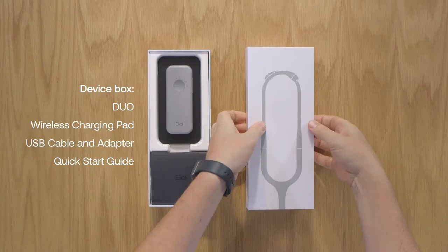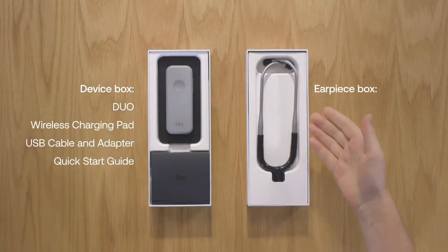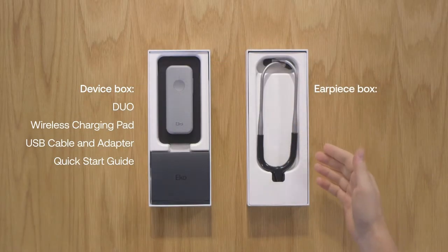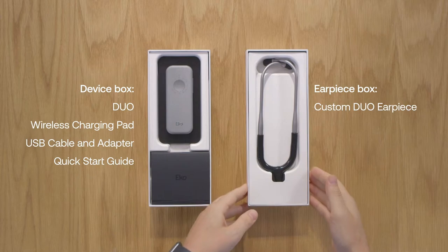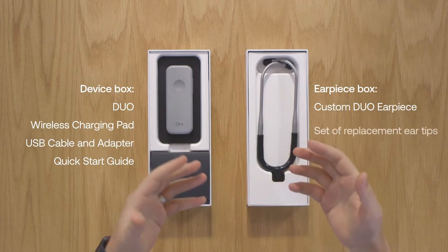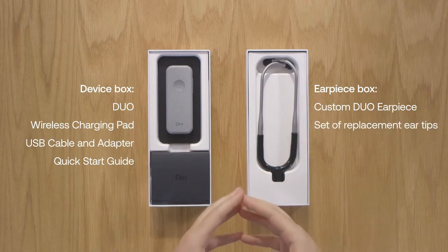If you purchase the Duo earpiece it will arrive in a separate package which will include the custom Duo earpiece and one set of replacement ear tips. Both boxes are 100% recyclable so you can dispose of them consciously.